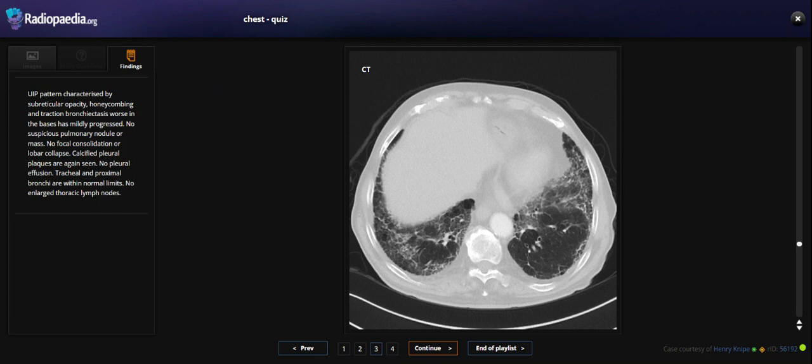This finding represents a UIP pattern, which is characterized by subpleural basal opacity, honeycombing, and traction bronchiectasis at the base. This has mildly progressed. No suspicious pulmonary nodule or mass, no focal consolidation or lobar collapse, calcified pleural plaques are again seen, no pleural effusion, trachea and proximal bronchi are normal. No enlarged thoracic lymph nodes.